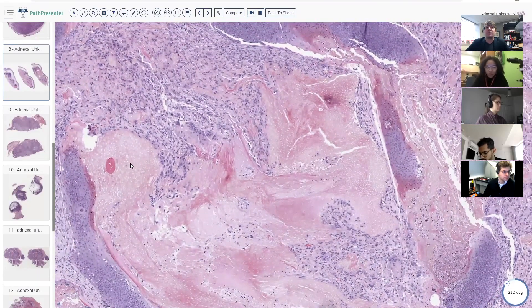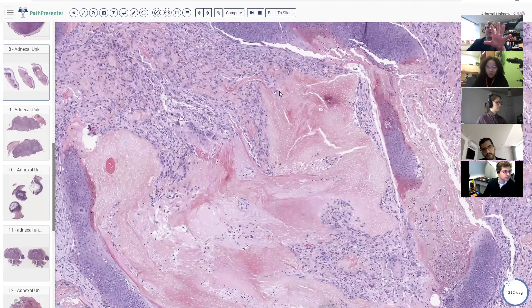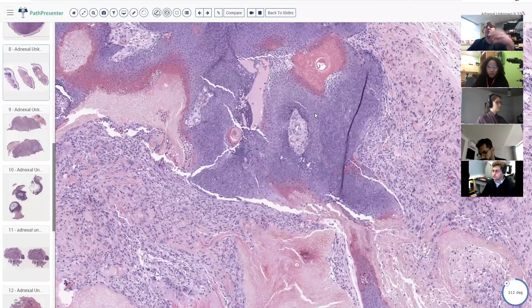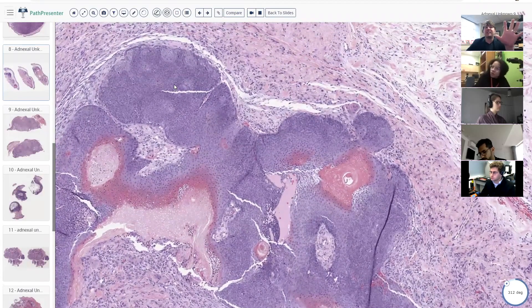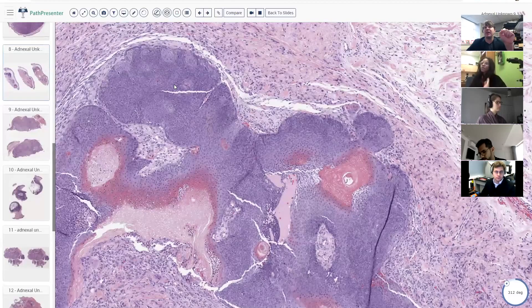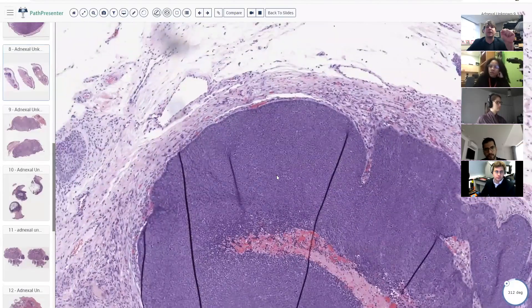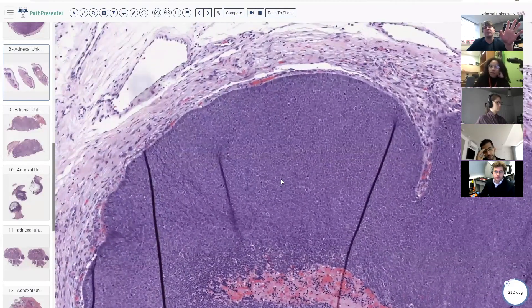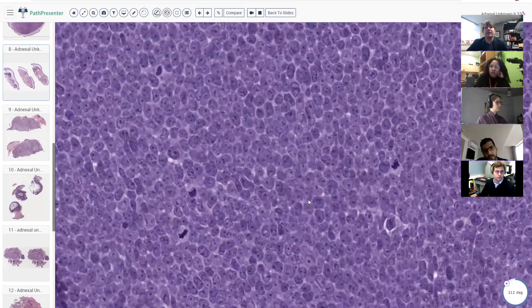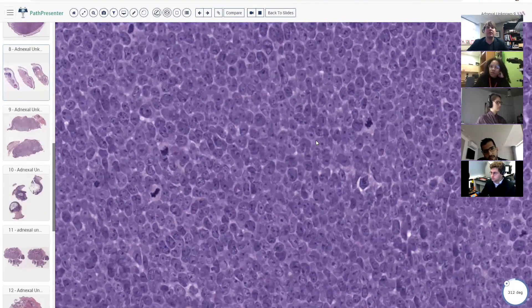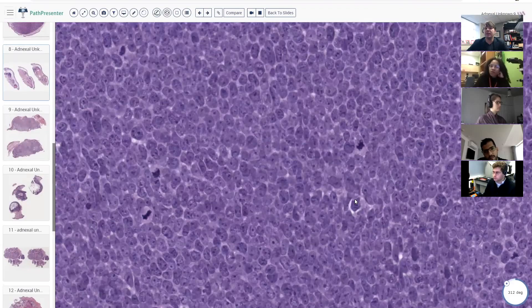A lot of times pilomatricomas are totally burned out and all you have are sheets of ghost cells and reactive change, with none of the blue basaloid cells. Because of that, sometimes when people first see one with nice big sheets of basaloid cells they get a little freaked out. This is why you don't start at high power — if you go straight to high power and see sheets of round blue cells with two or three mitoses per high power field, 30 per 10 high power fields, you're going to call this something malignant.